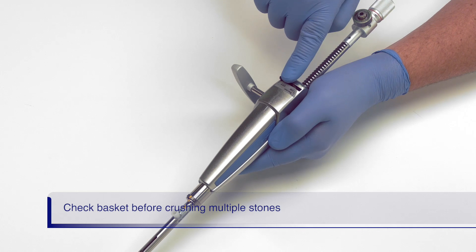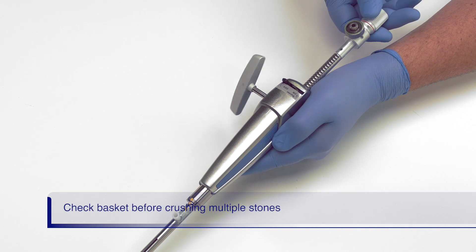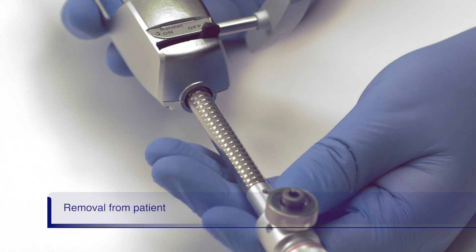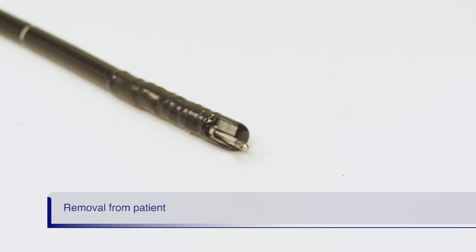Turn the ratchet off and check that the basket can reopen smoothly. Apply gentle pressure to the back of the handle to reopen the basket. Smoothly open and close the basket before crushing additional stones. If the basket does not smoothly open and close, remove it from the patient and use a new basket to ensure no trauma is done to the duct. When removing the basket from the patient, ensure the basket is fully closed, turn the ratchet off to relieve tension in the sheath, then remove the basket from the patient.